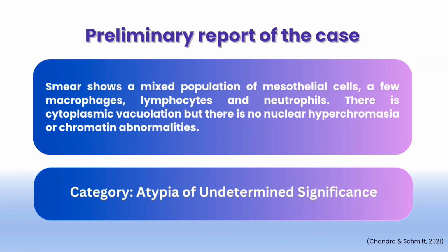The preliminary report for this case came out under the category atypia of undetermined significance because cytoplasmic vacuolation was observed. However, the nucleus does not show any abnormal characteristics. Therefore, it is not suitable to be categorized under suspicious for malignancy or negative for malignancy. Additional lab analysis is required for further investigation.